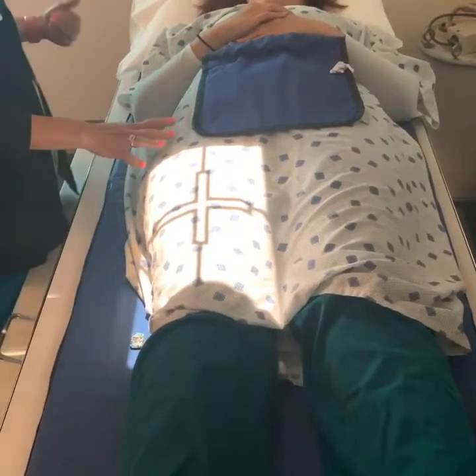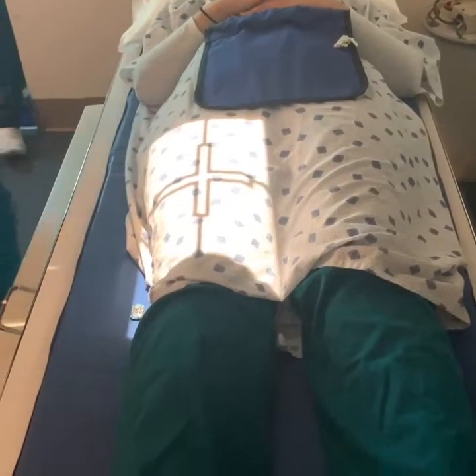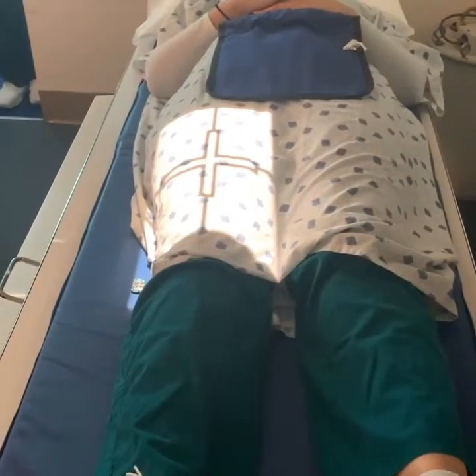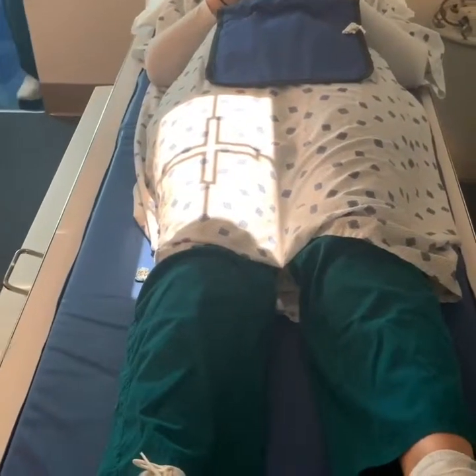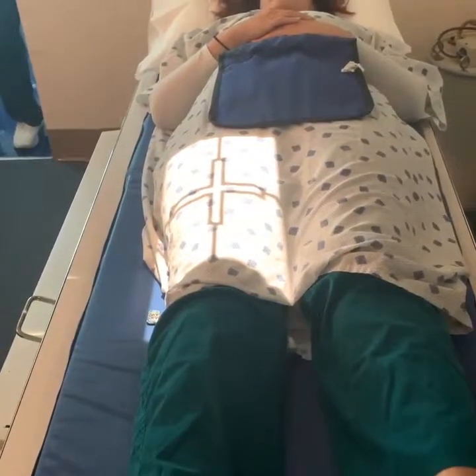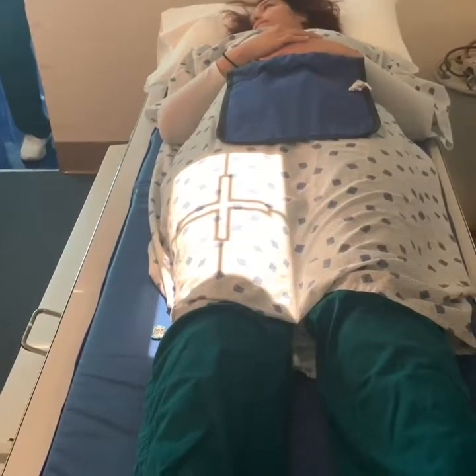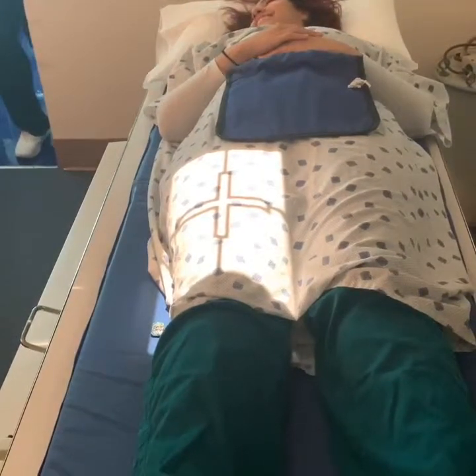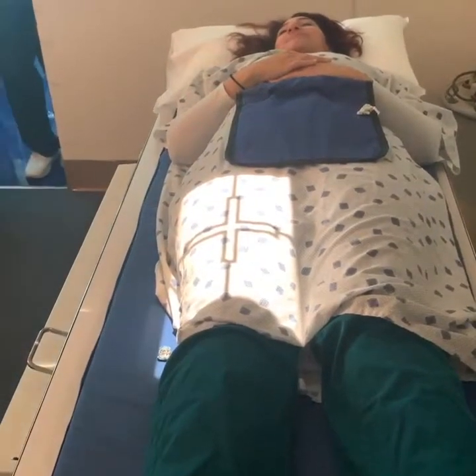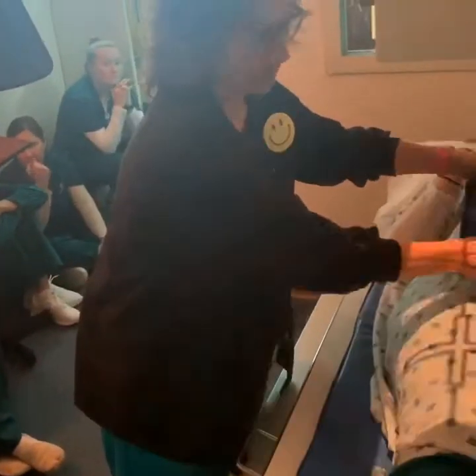I'm just gonna have you stop breathing when I go to take that exposure and hold your leg just like that, okay? Okay. All right. Go ahead, stop breathing for me. Good. You can breathe, relax for 1 second. All right. Now what we'll do is, I'm gonna move this for a second.